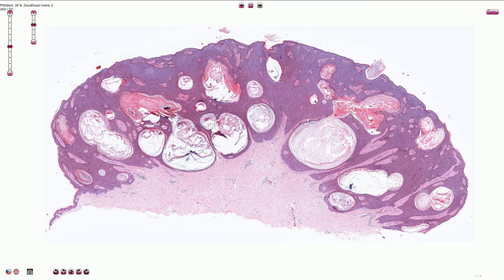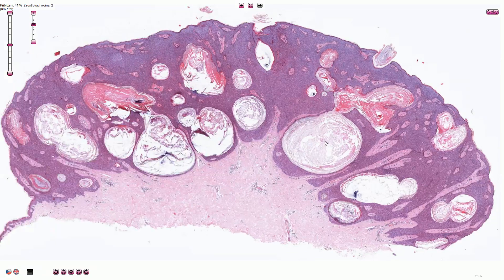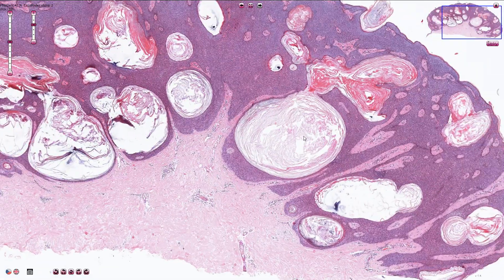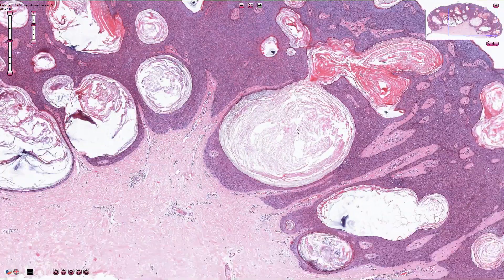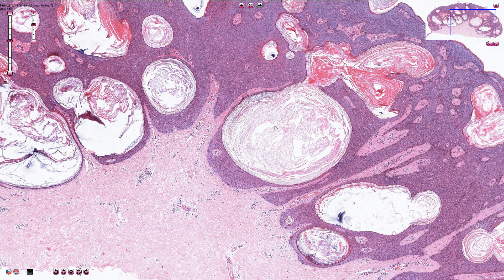Here is another example of the acanthotic form of seborrheic keratosis: a slightly elevated tumor with a smooth surface, acanthotic slightly pigmented epidermis, multiple horn cysts with abrupt keratinization, and without any parakeratosis.